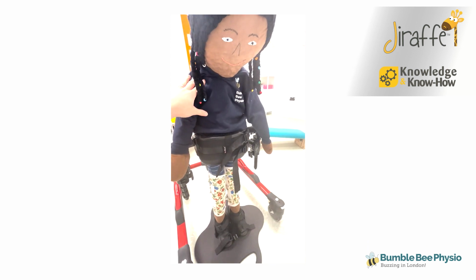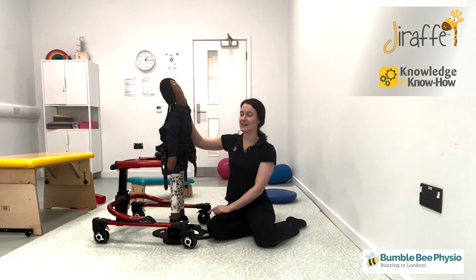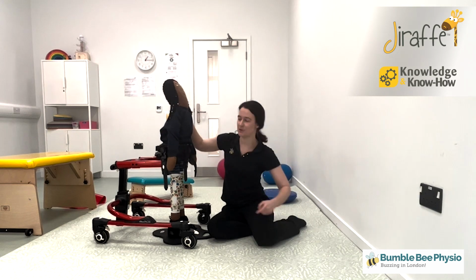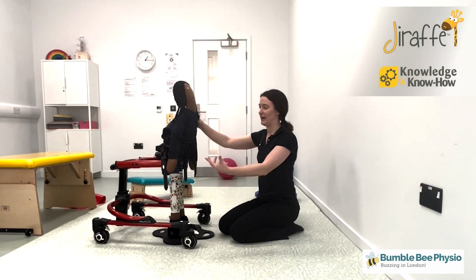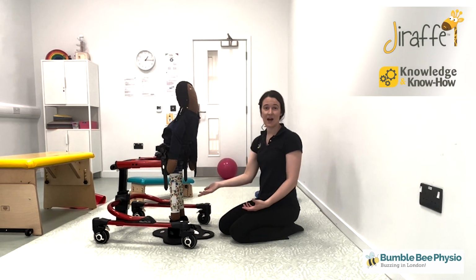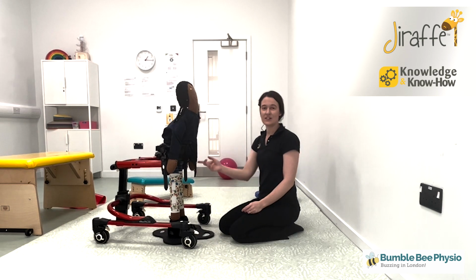So as you can see from this video, we've now got the child standing completely upright with this ability to flex forwards, and we're going to encourage them to come down, reach things, and to come up again. And we know that this is isolating the hamstrings only, because their knees are straight, their feet are still, and they're going to get that stretch.